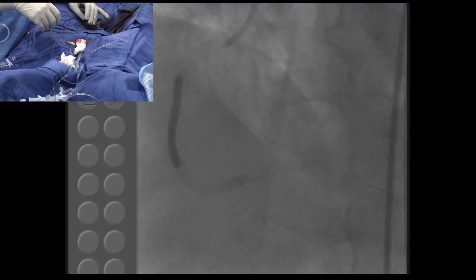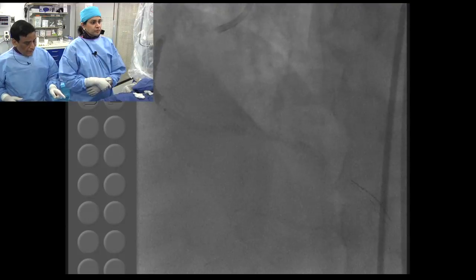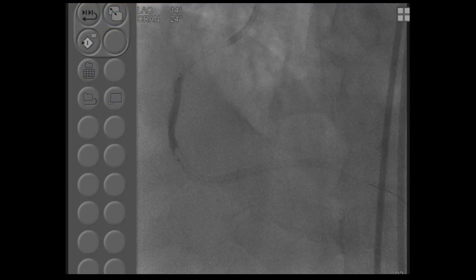Now we have the post dilation, right? Yeah. That we can do later, but I think we can come. We show the last picture, and we just sum it up, and then we just do a little post dilatation, which is just a follow-up once we bring it back into the guide. One second.